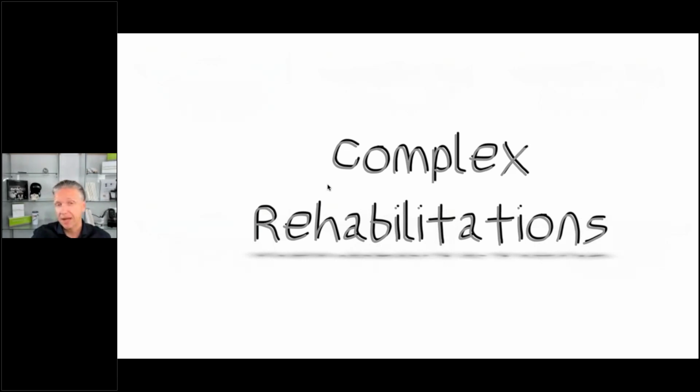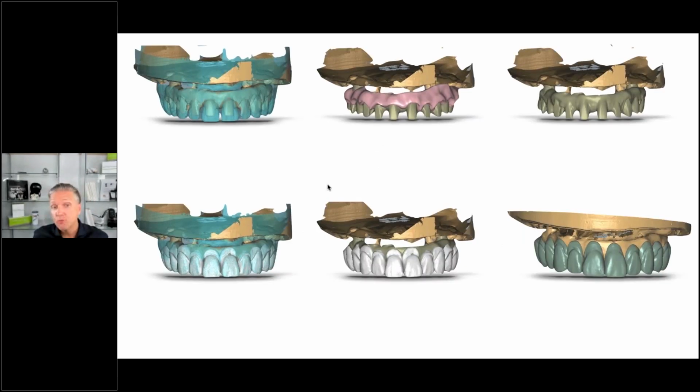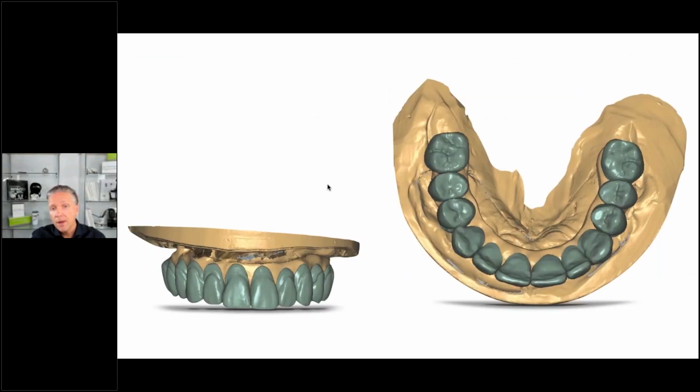Something like this. These are restorations I like the most to do right now in regards to full mouth or full arch reconstructions. Basically, I call it a Thimble Bridge. We're creating a framework or a bar with individual preps, having then created individual crowns, pressing them in lithium silicate, and finishing everything up with composite in terms of the pink aesthetic.